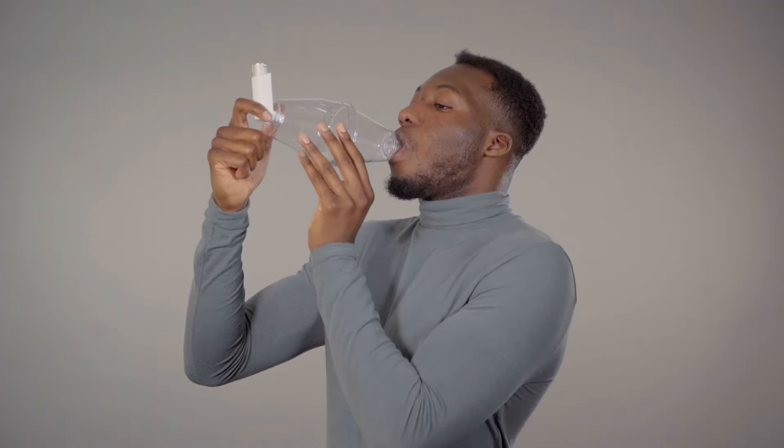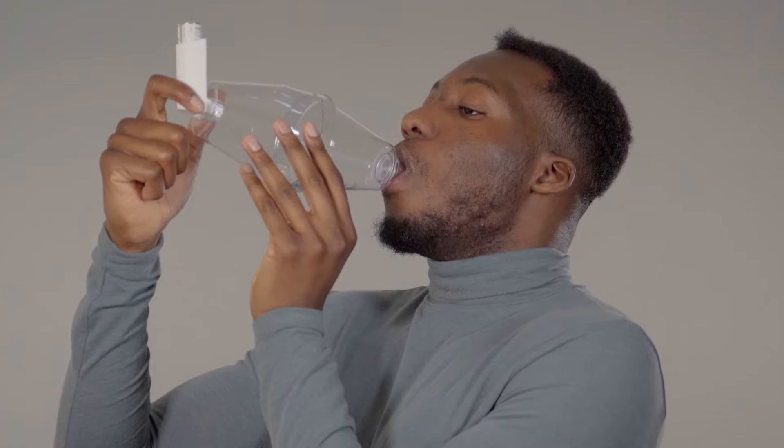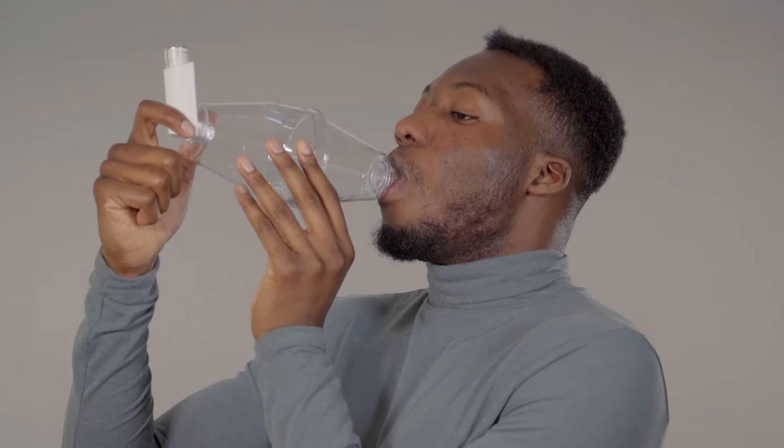Some small volume spacers make a whistling sound if you are breathing in too fast. If you are using a large volume spacer like this one, you can use the same breathing technique. With tidal breathing, your spacer should make a clicking sound as the valve opens and closes. When you've finished, take the inhaler out of the spacer and replace the caps on both the inhaler and the spacer.